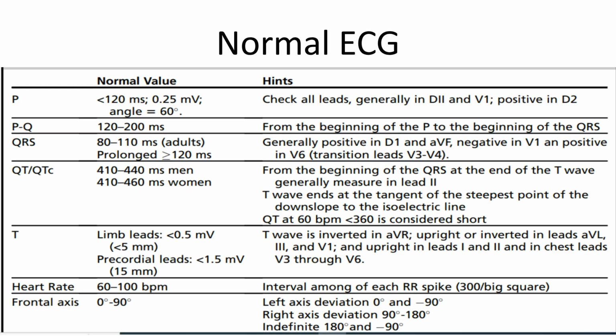Welcome to this video on ECG review. Let's review the normal values and hints for key components of a standard ECG, including P-wave, PQ interval, QRS duration, QT-QTc, T-wave, heart rate, and frontal axis.